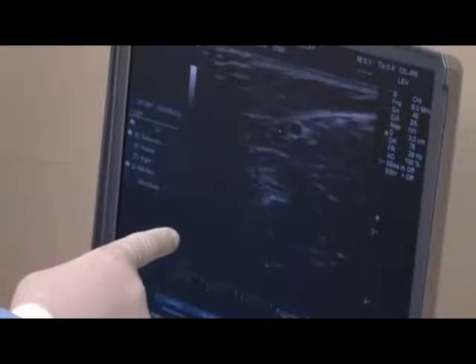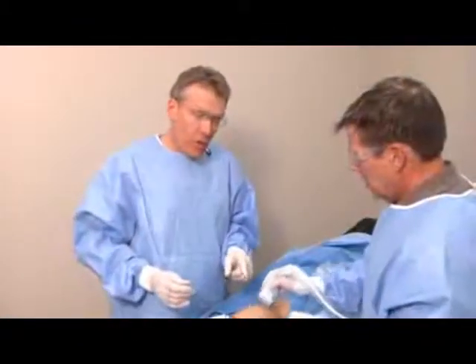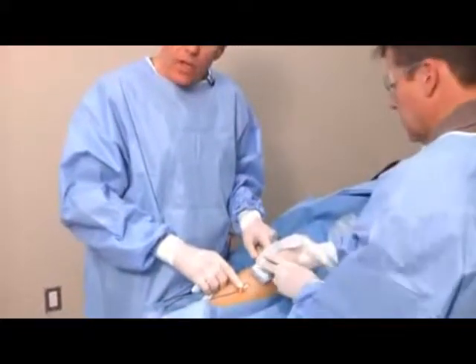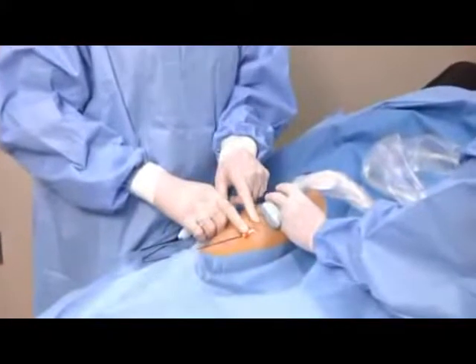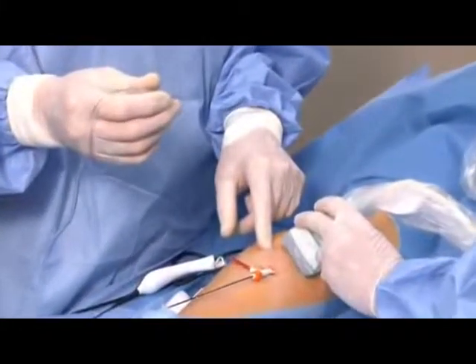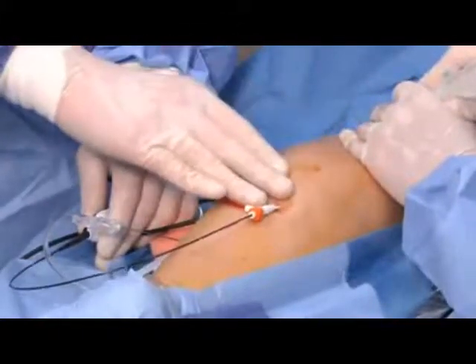As I back in, we'll see the catheter come into the lumen of the vein right there — there's a bright echo. We've introduced the catheter from its entry site to the back of the knee. The next step in this multi-step process is to provide some fluid anesthesia. We surround the catheter with a combination of water, lidocaine or novocaine, and sodium bicarbonate — we provide tumescent anesthesia along the length of the catheter.